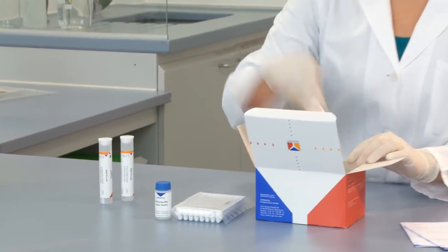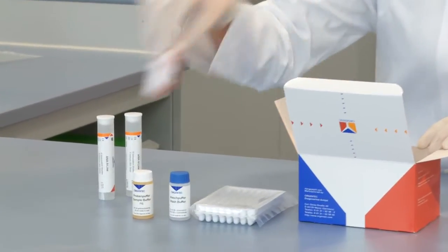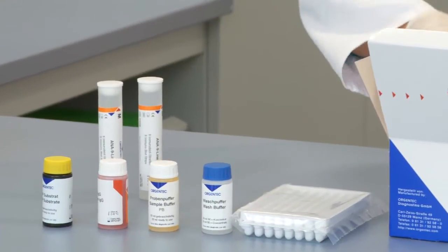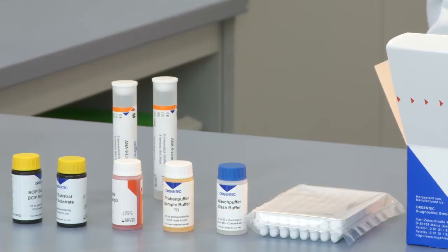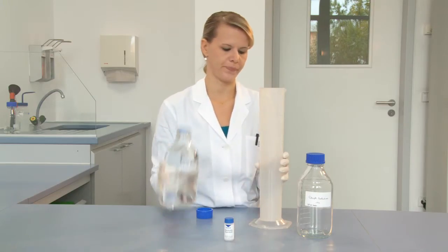The kit also contains sample buffer, a solution containing an enzyme-conjugated secondary antibody called the conjugate, and the substrate solution for the enzyme. The wash buffer is provided as a concentrate.